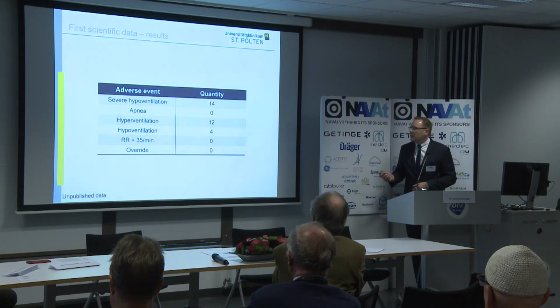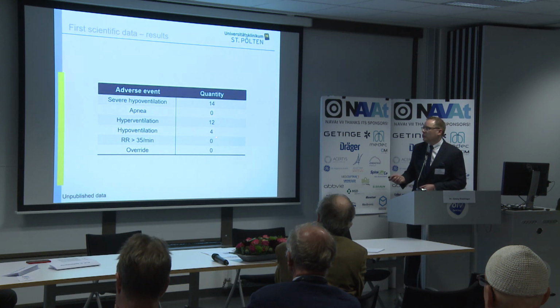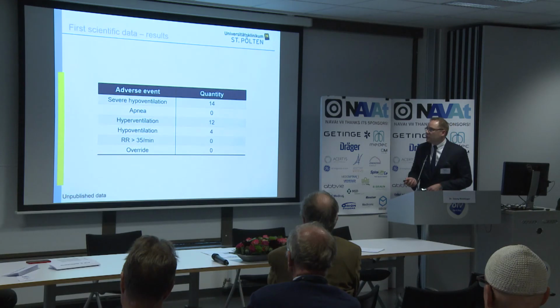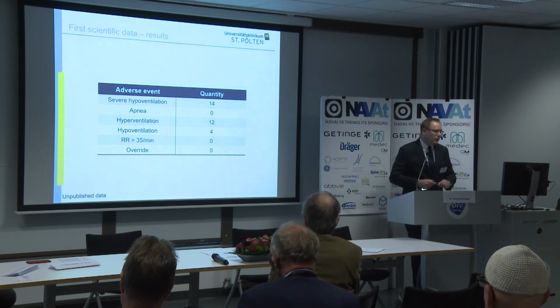So what were our results? We had some adverse events. We had 14 events of severe hypoventilation, 12 of hyperventilation, 4 of hypoventilation. These 14 here being defined by the minute volume. I'll come back to that in a second. We didn't have any apneas, tachypneas, or any override by the anesthetist in charge. And these events happened, but smart ventilation control was capable of managing them and bringing the patient back into the desired corridor again.